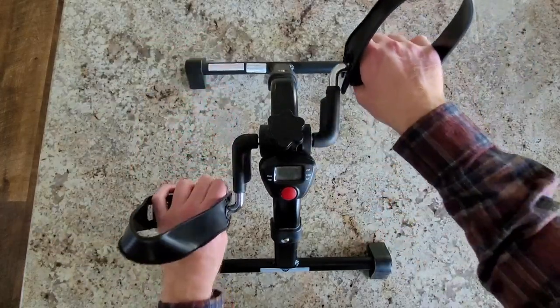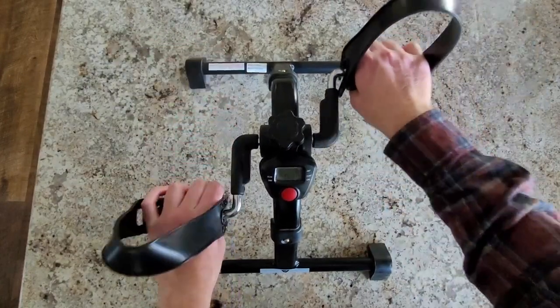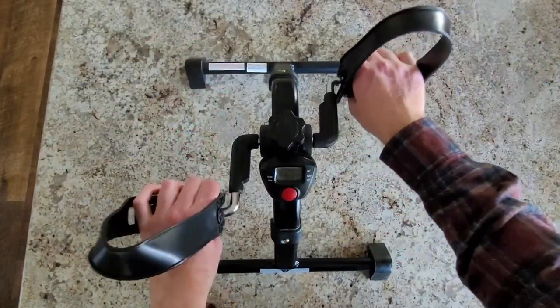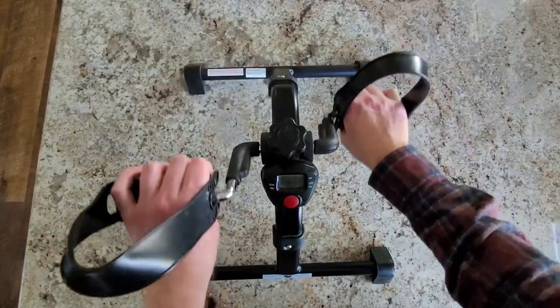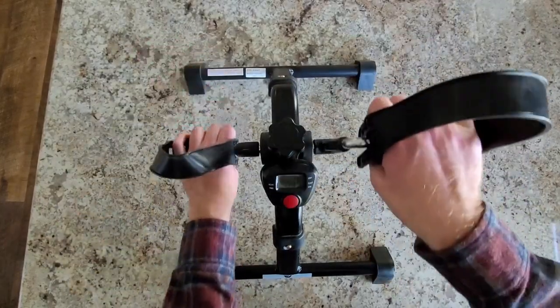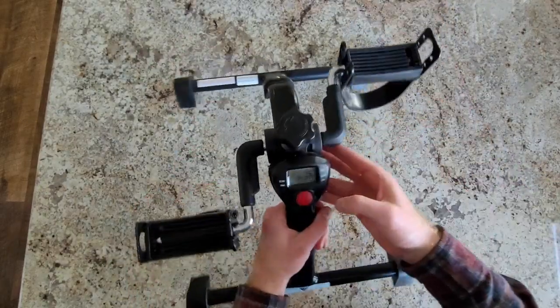There is this counter as well. It does calories, and it counts how many rotations this does, so you can really keep an eye on what you're doing — what are you exercising, how many calories are you burning off, did you make a record with how many rotations you made with the peddler? You can see here the screen that it comes with, which is very good and very convenient.